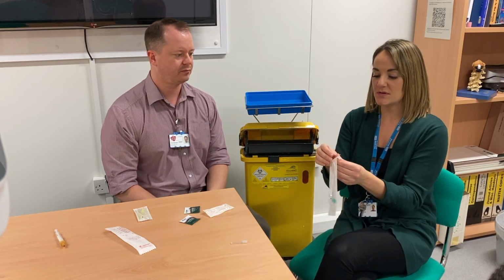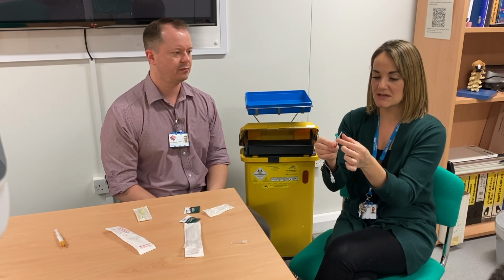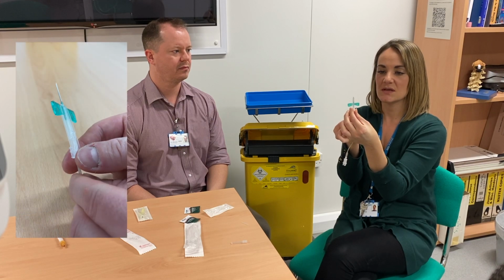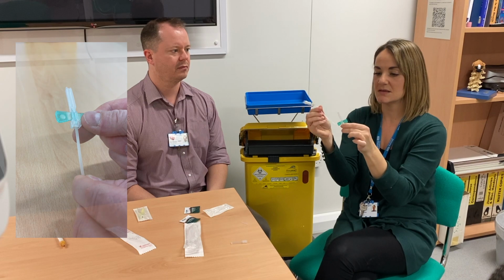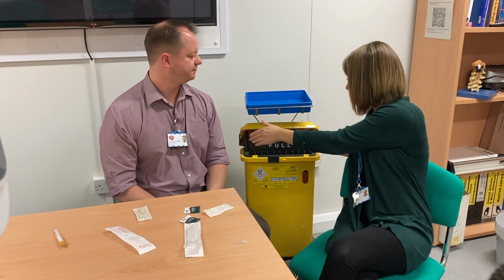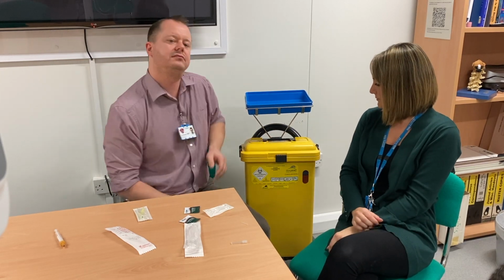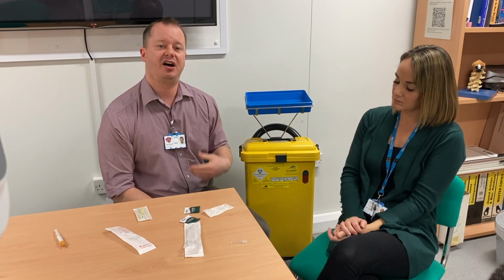We'll go through all these when you do phlebotomy. There's also what we call a butterfly needle. Again, that has a sharps safety device where you just slide it up. Slide it up when you've used it, it clicks, and straight into the sharps bin like that. And then when you're finished, obviously, close it up.